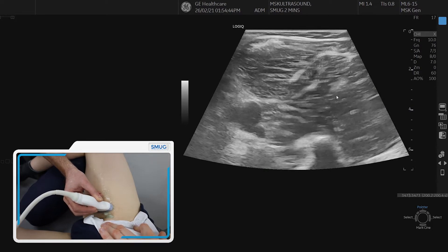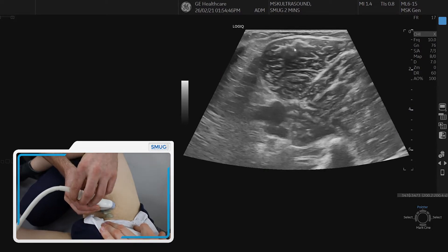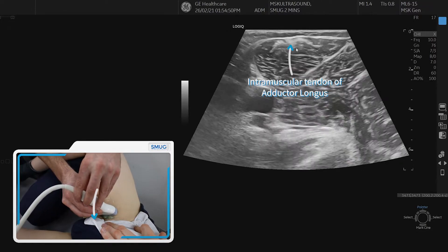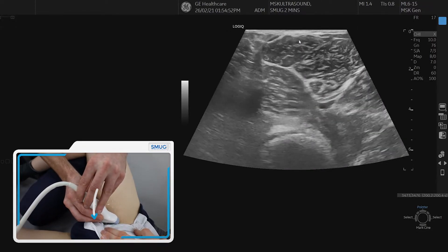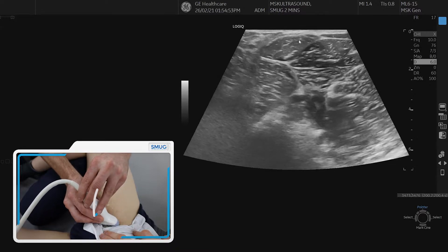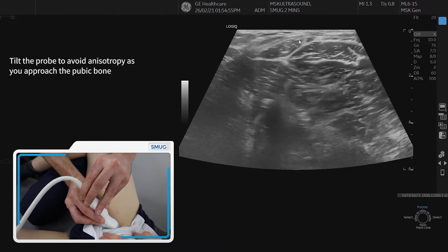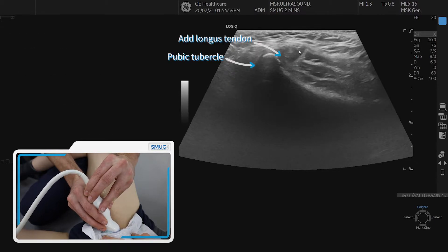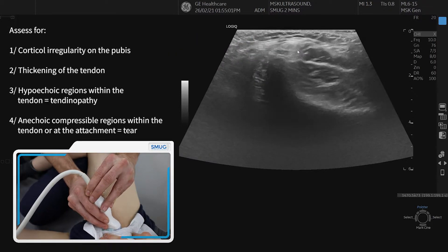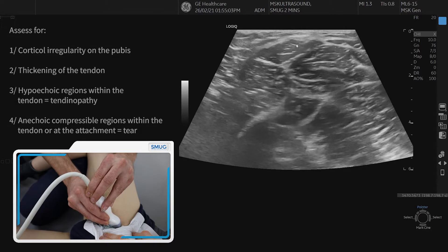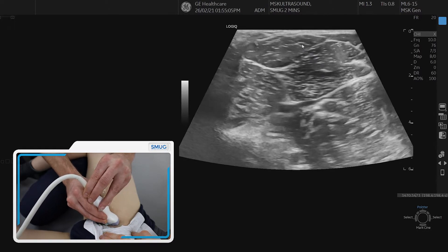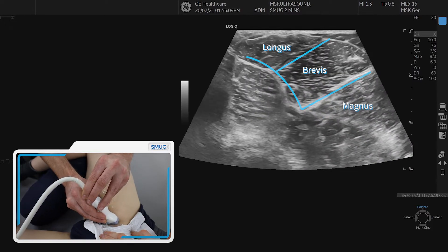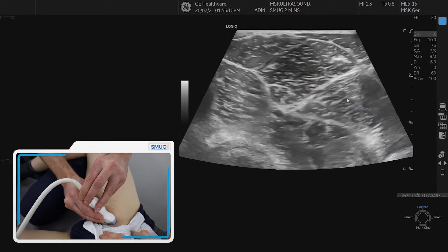If we go up to the adductor longus we can follow that intramuscular tendon and the musculotendinous junction up towards the pubic bone where it attaches on, looking for any hypoechoic regions or any tears. Coming a little bit more distal again, we can see the three compartments of adductor longus, adductor brevis, and adductor magnus.